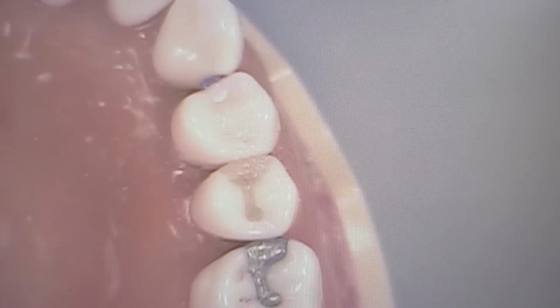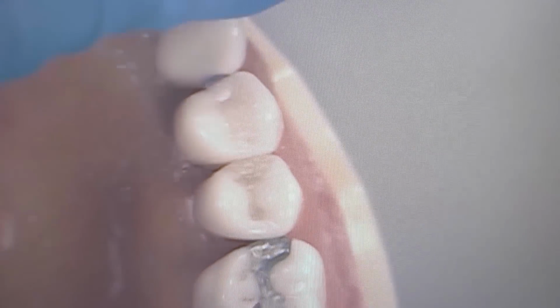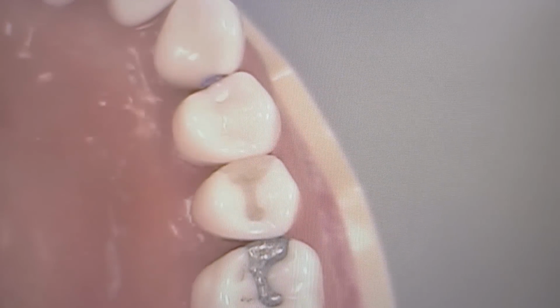Air blowing just to remove the excess composite. Just removing excess composite. Good. I think that's our class 2 composite restoration.